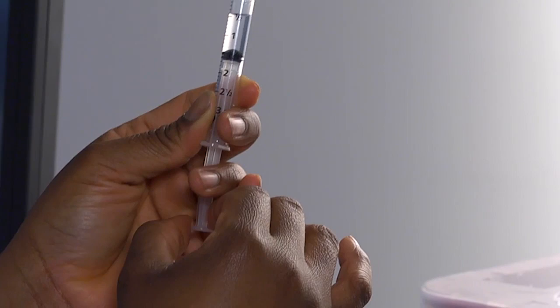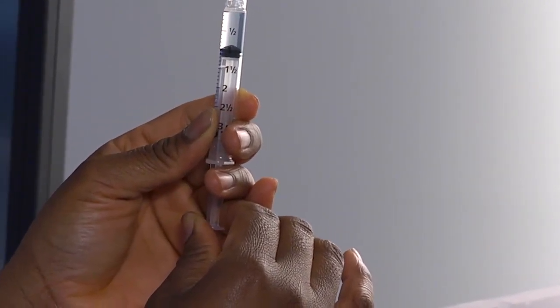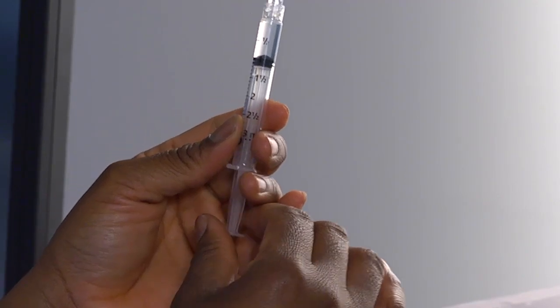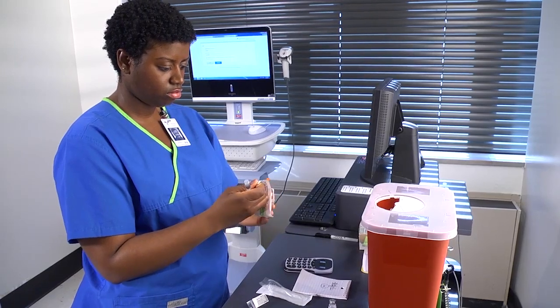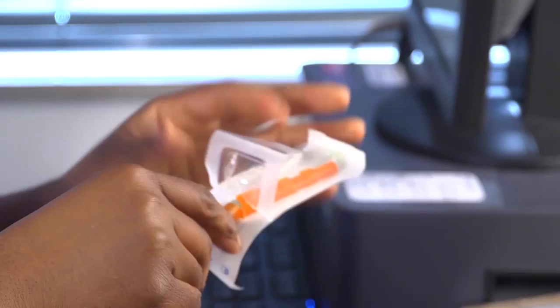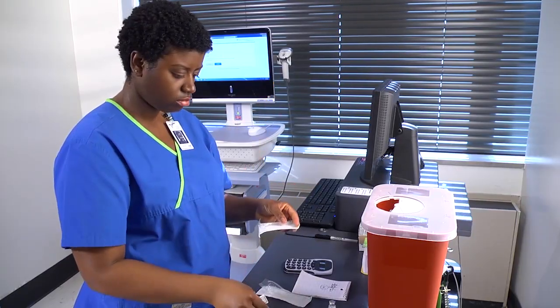Make sure you have the correct volume and no air bubbles. Remove any remaining air by tapping the barrel to dislodge the bubbles. If air remains, draw back slightly on the plunger and push up to eject the air, taking care not to eject any fluid. Recheck the volume of the drug in the syringe. If you're using a needleless device or filter needle, replace it with a safety needle of the appropriate gauge and length before administering the medication to the patient.